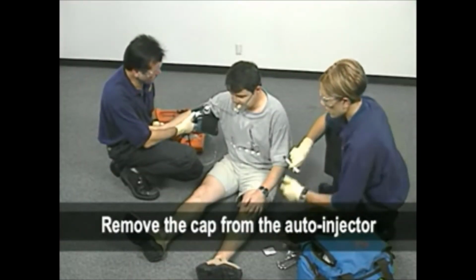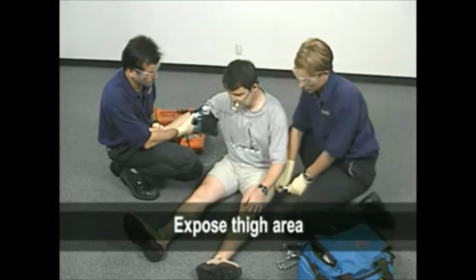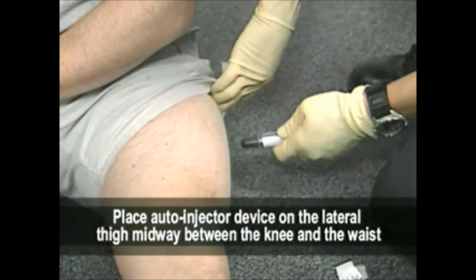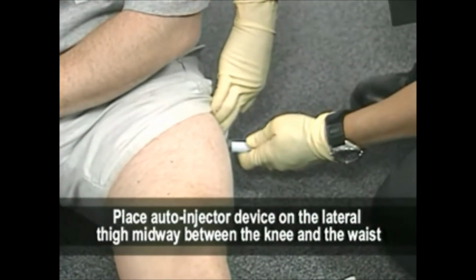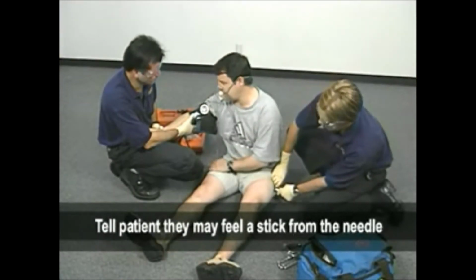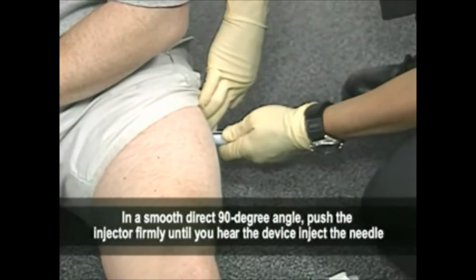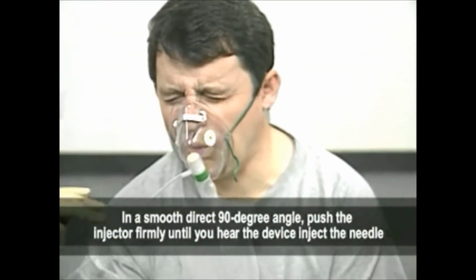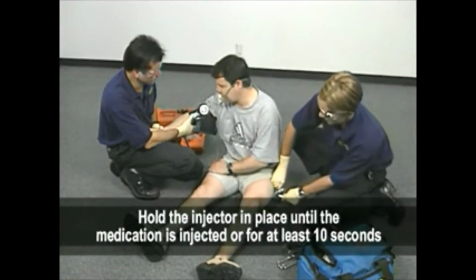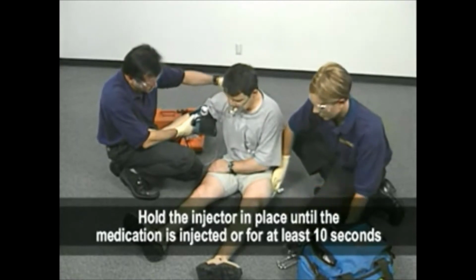Remove the cap from the auto-injector. Expose the thigh area. Place auto-injector device on the lateral thigh, midway between the knee and the waist. Tell patient they may feel a stick from the needle. In a smooth, direct 90-degree angle, push the injector firmly until you hear the device inject the needle. Hold the injector in place until the medication is injected, or for at least 10 seconds.